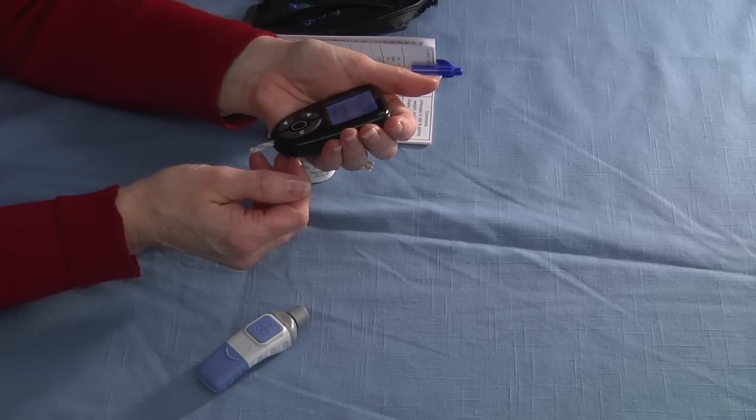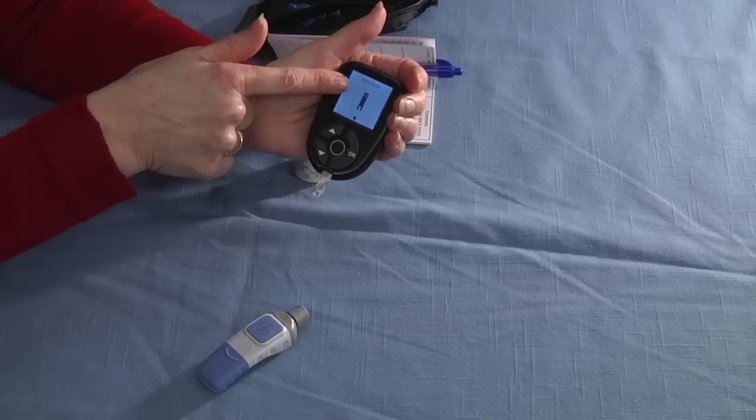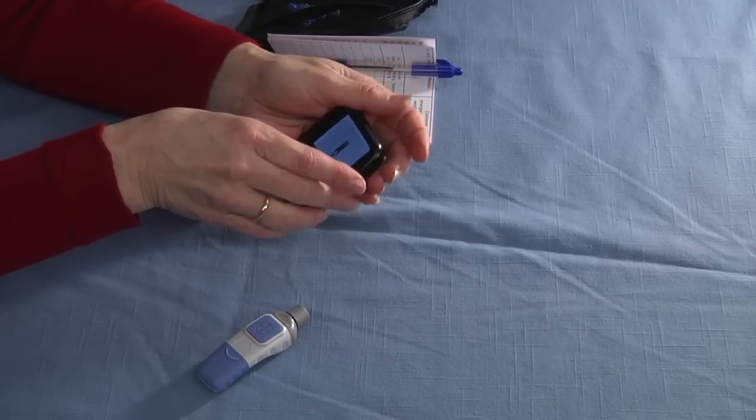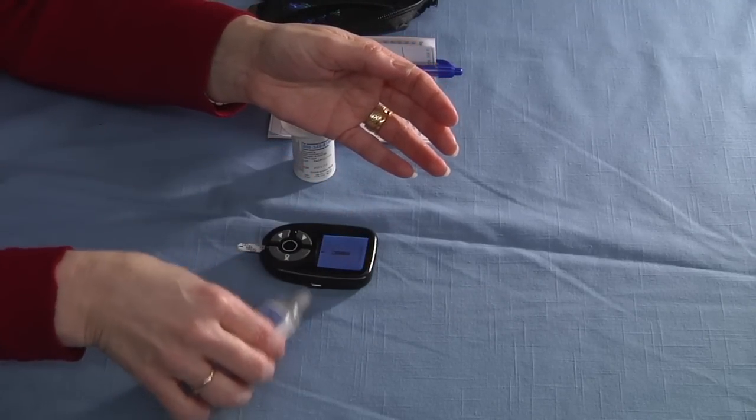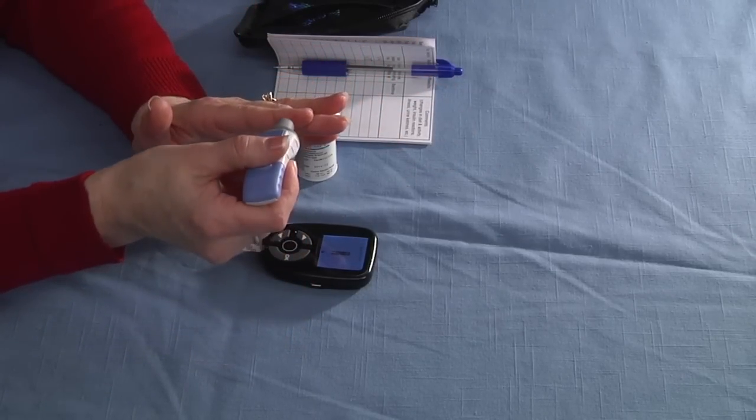Then you're simply going to wait until the meter prompts you or follow the pictures. It's asking for a drop of blood. At this point, I'm going to take my lancet holder and I'm going to hold it against the side of my finger.